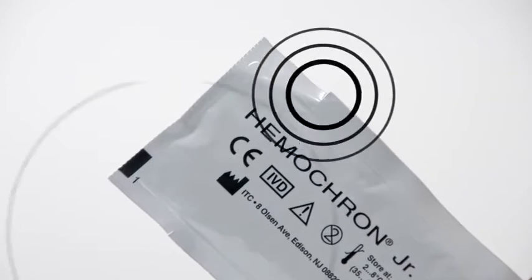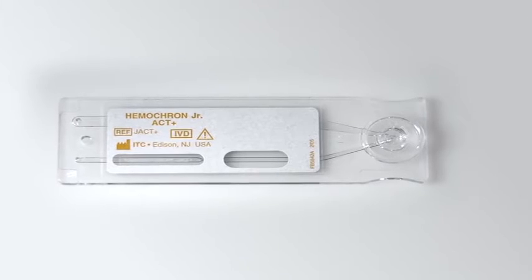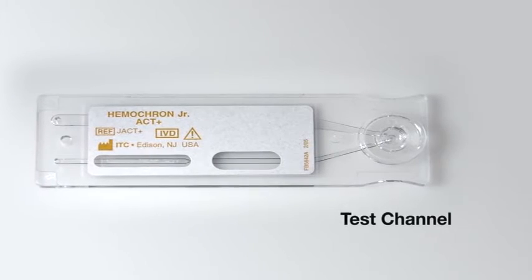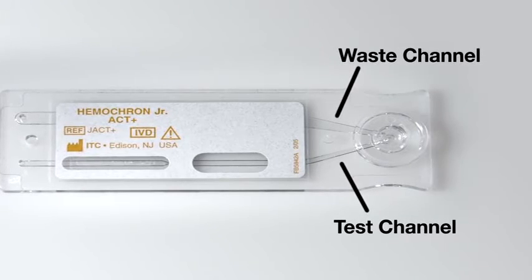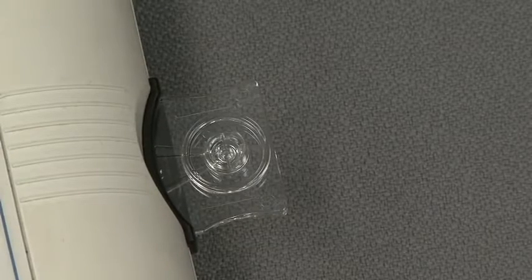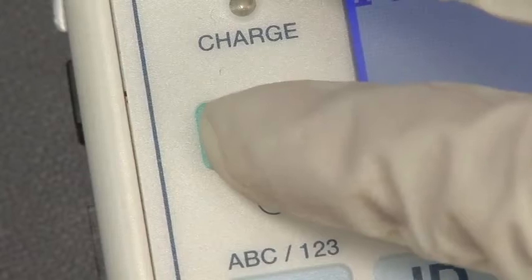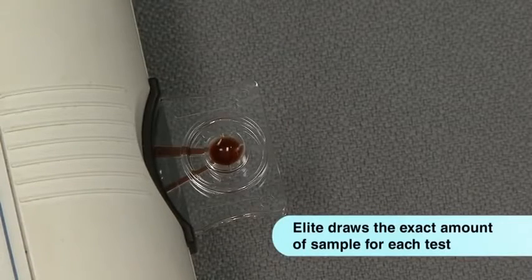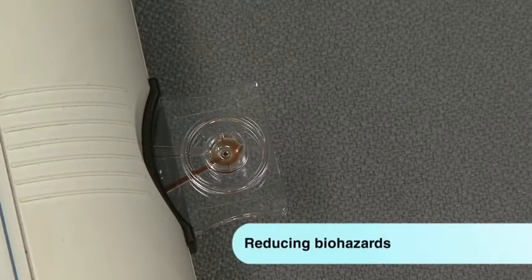When you are ready to test, open the cuvette using the tear tab on the pouch. If you look closely at a cuvette, you'll see that it has two channels: the test channel and the waste channel. The Hemocron Junior cuvettes mimic the capillary action of the body by pumping the blood back and forth over a restriction in the test channel until an endpoint clot is formed. The cuvette's sample well holds less than 50 microliters of blood, and this small sample volume supports blood conservation protocols.